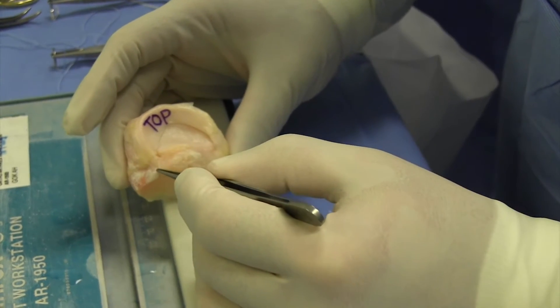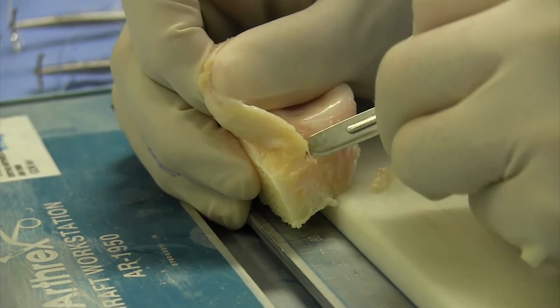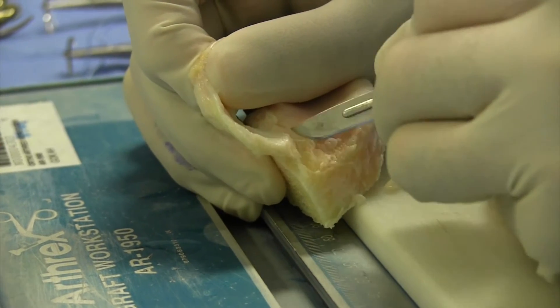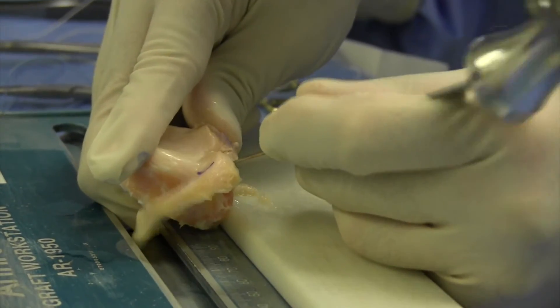Here you see the donor meniscus, including ligaments, fixed on the donor tibia plateau. The anterior horn is taken off with the ligament from the bone. The posterior horn ligament is taken off with a small piece of bone. I take that with a scissor.